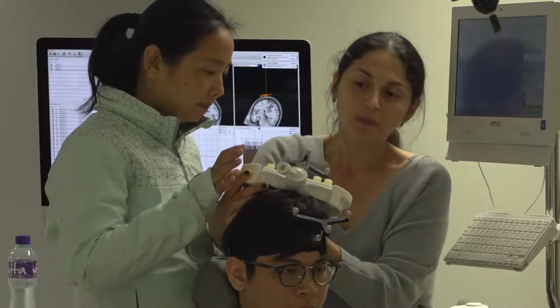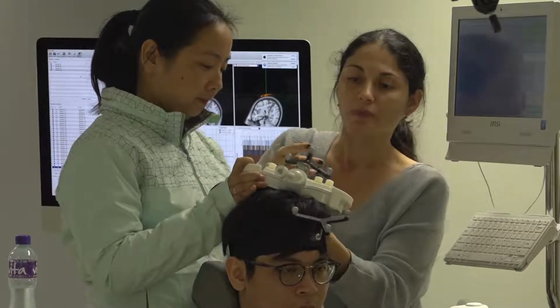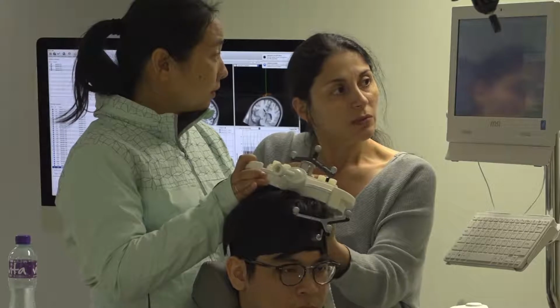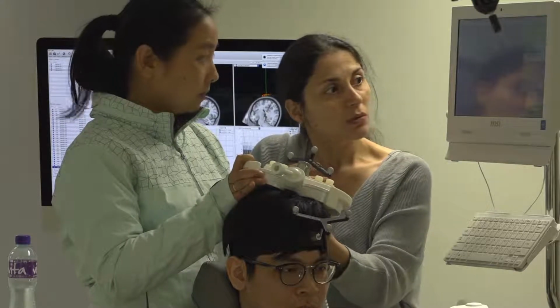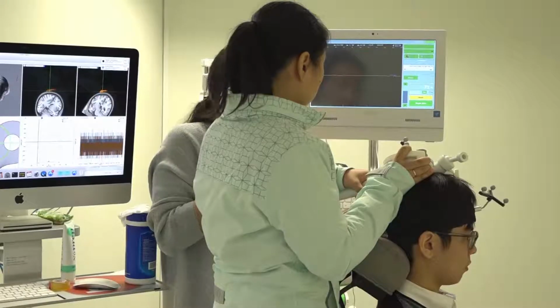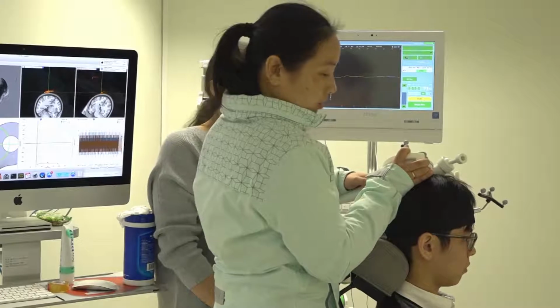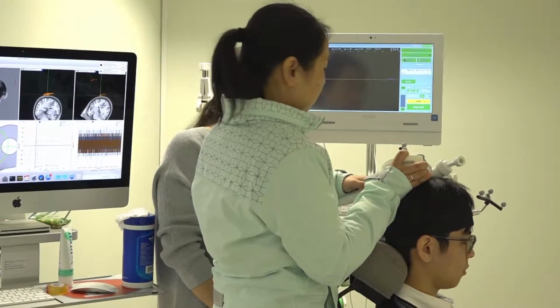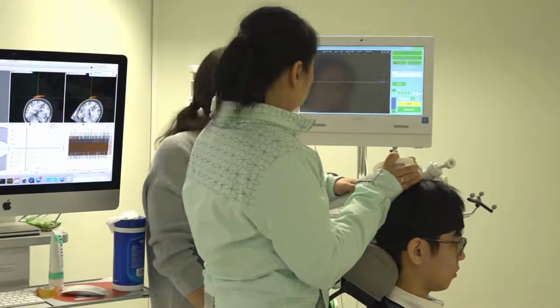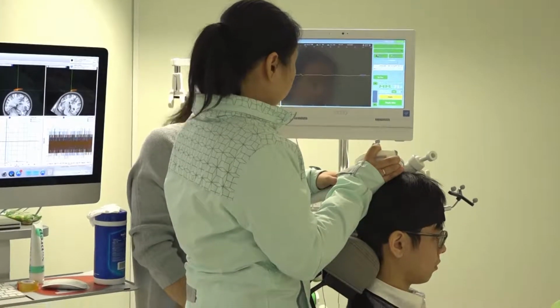It will be 45 degrees. Wait, I'm going to put more. With 70, he's making me try to do that. Yeah, here you'll be able to. You see, there. Wait four seconds.